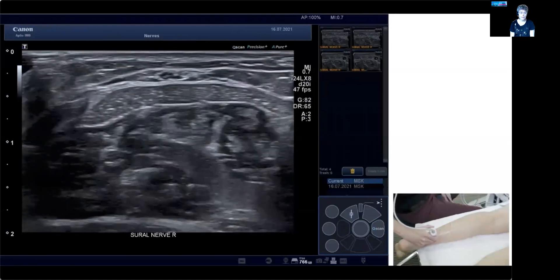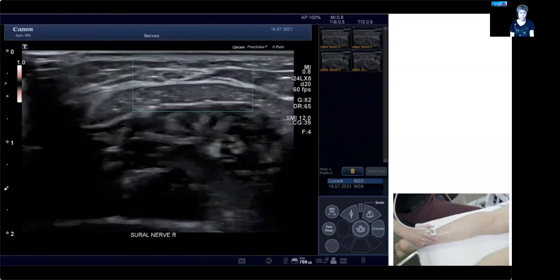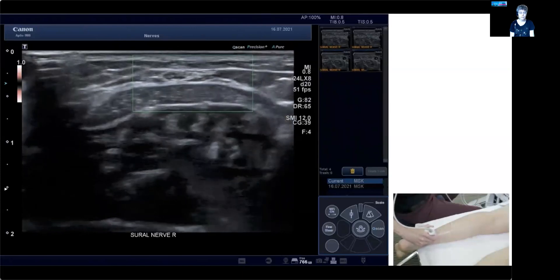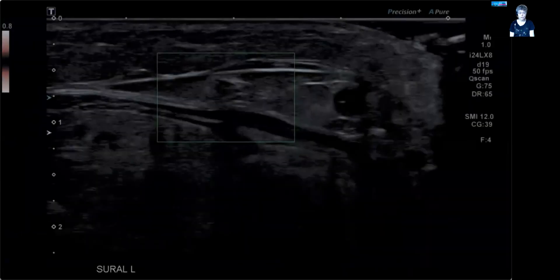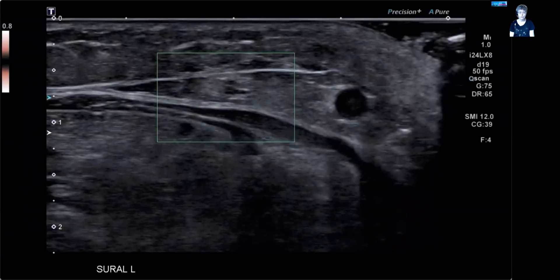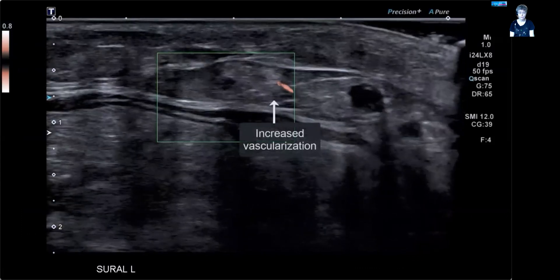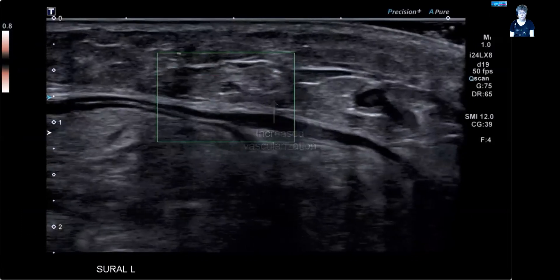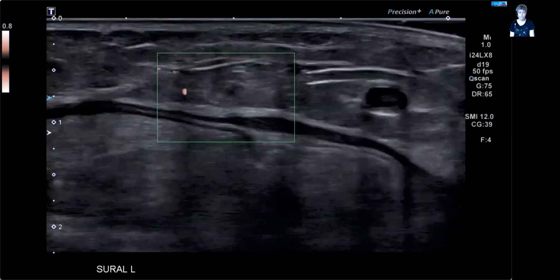We are quite distal now — you can see the gastrocnemius turning into the Achilles tendon with the soleus still underneath. Here's a small case example of a patient who had vasculitis, and we wanted to check the sural nerve to see if it was suitable for biopsy. It is suitable because there's edema surrounding it in the perineurium and increased vascularization of that nerve, so very likely it is involved in the vasculitic process. It also had abnormal nerve conduction.